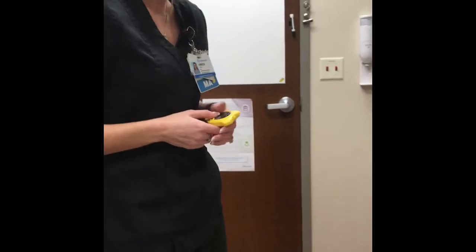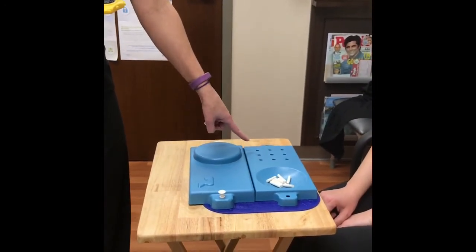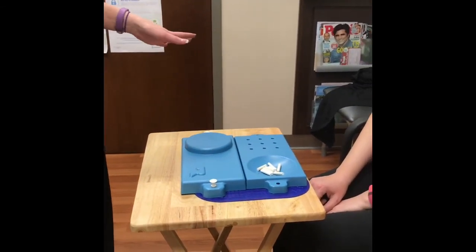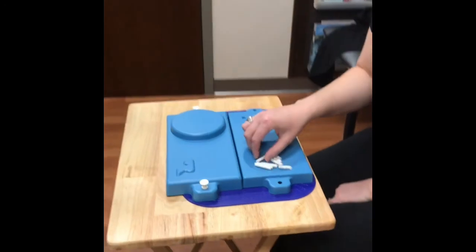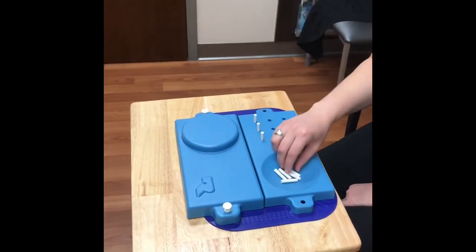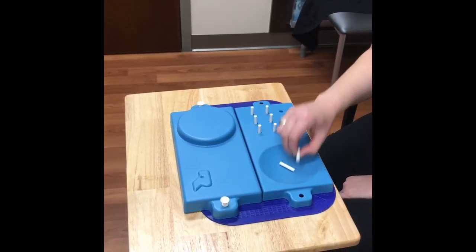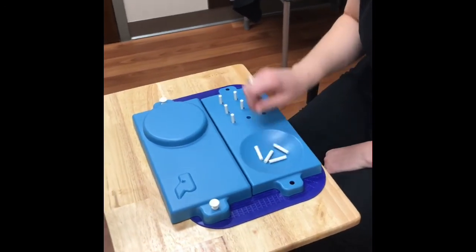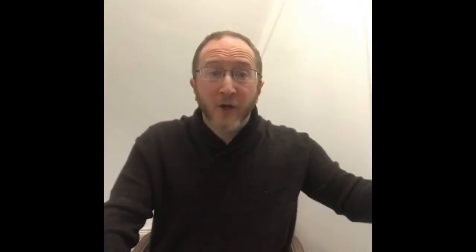Okay, we're going to do your nine-hole peg test. What you will do is you'll pick one peg up at a time, place them in the holes. Once this entire side is filled, you will take them all right back out one at a time. And if they fall, that's okay — I'll pick them up for you. But you want to go as fast as you can. Whenever you're ready. And there you go.